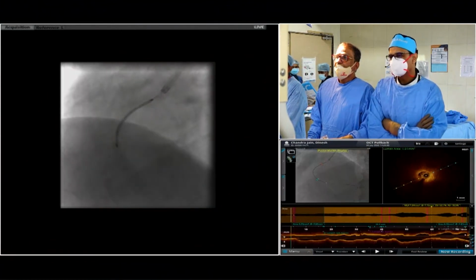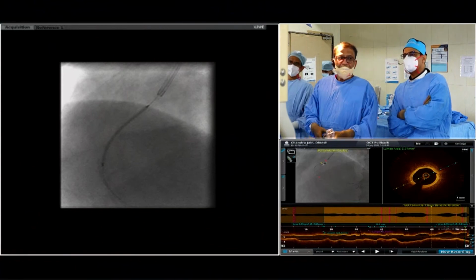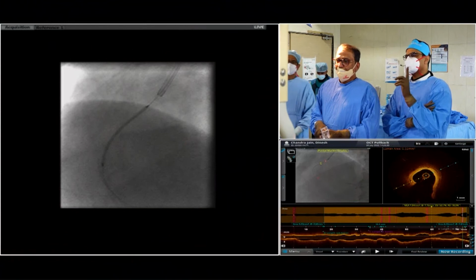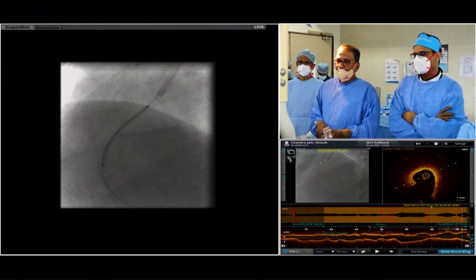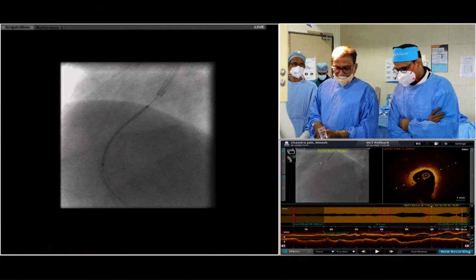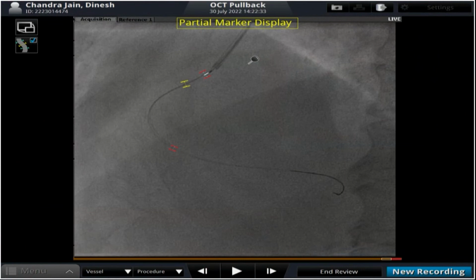So if you implant the stent, we will demarcate this, Ajay. We will have to go right now. Yes, sir. You'll do the OCT, and we'll come back to you. Then you show us the OCT. Okay, super. So we have to switch, I think, to Dr. Praveen Chandra.